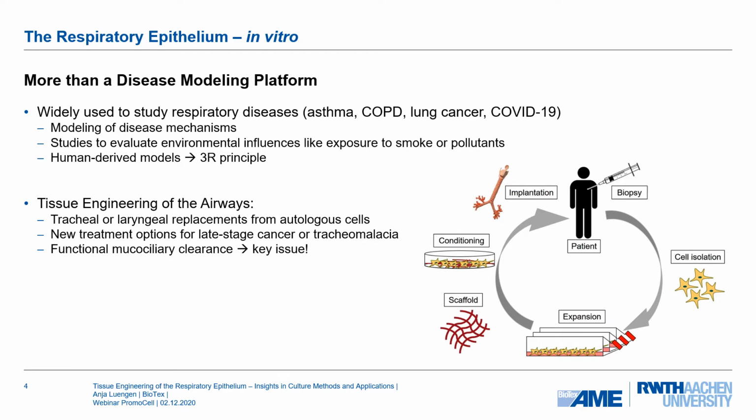In vitro models of the respiratory epithelium have gained more and more influence in the past. Their value in studying respiratory diseases such as COPD or asthma was recognized long before the COVID-19 pandemic.